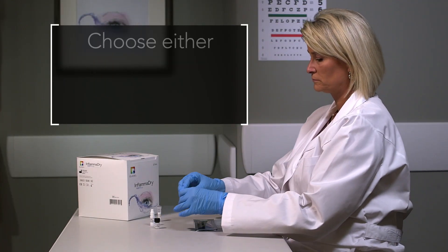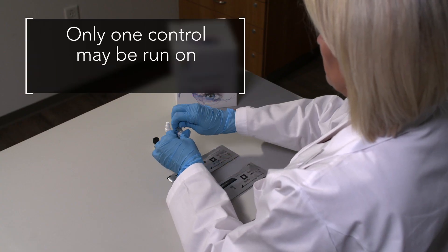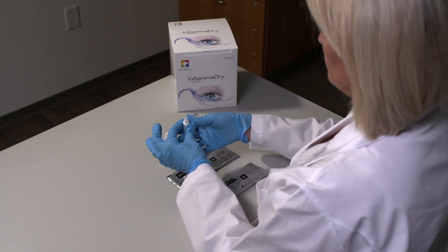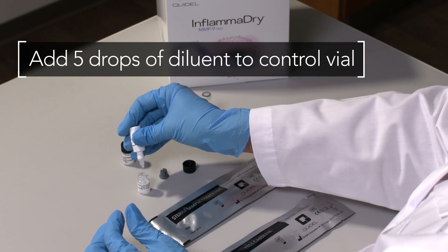Choose either the positive or negative external control vial. Only one control may be run on each InflammaDry test. Remove the cap and rubber stopper from the selected control vial and add five drops of diluent from the diluent bottle, one drop at a time.